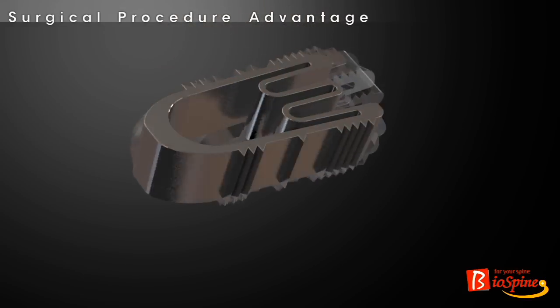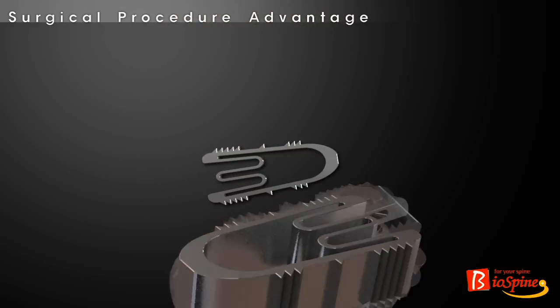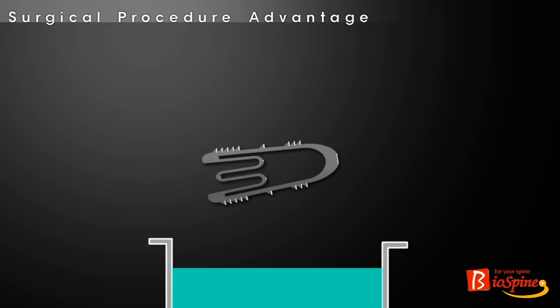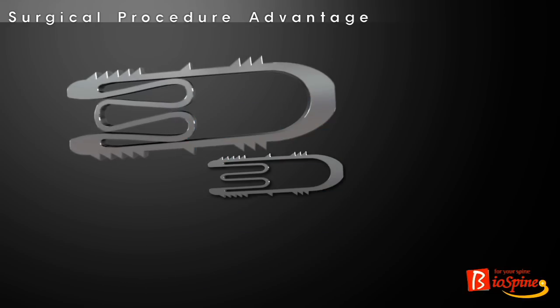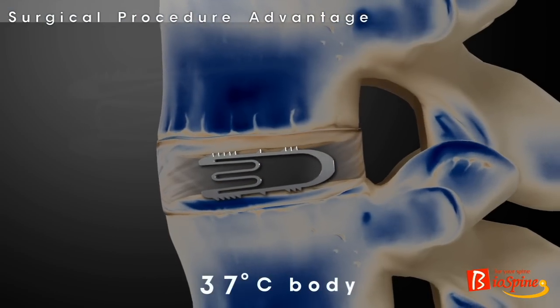Since the flexible cage system makes good use of self-setting by shape memory effect of nitinol, it has a very strong advantage in surgical procedure. That is, since flexible cage can be easily compressed in the water at 4 degrees Celsius, the height of cage becomes lowered. After it is inserted in the space between vertebral bodies, the flexible cage returns to the original shape at body temperature.